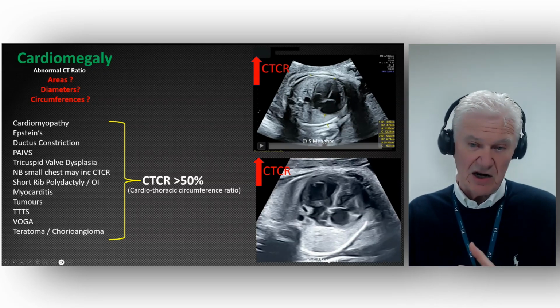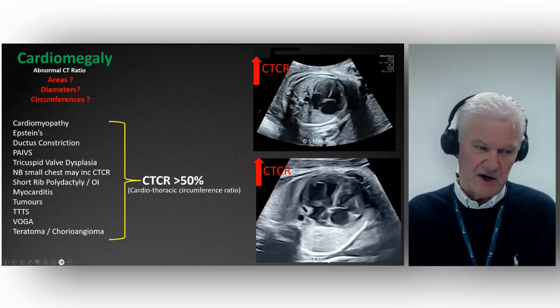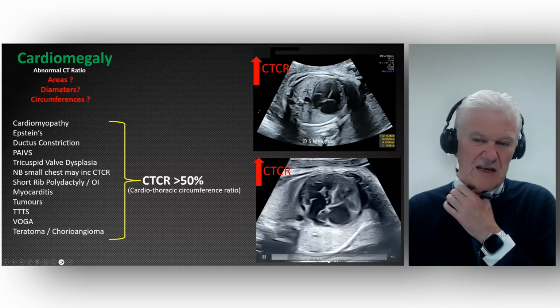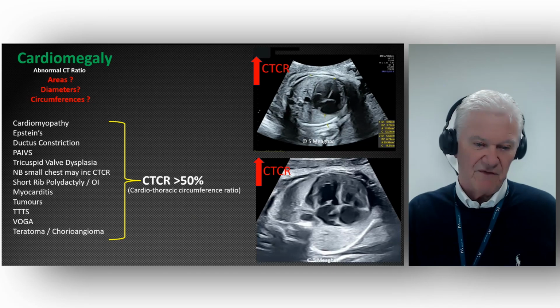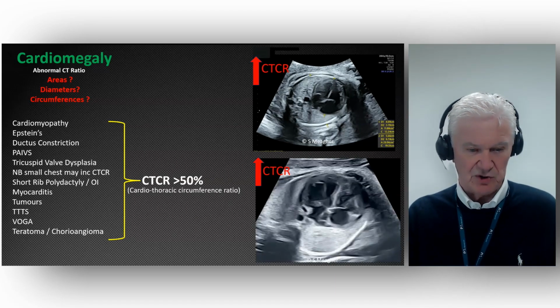And when you see that there's enlargement of the heart, by way of example, these 2 clips, then you look at this differential diagnosis on the left-hand side of the page. So when you see enlargement of the heart, you need to do a targeted assessment for these specific markers. Most importantly, look at valvular flow, laminar flow across the AV valves and the outflow tracts.